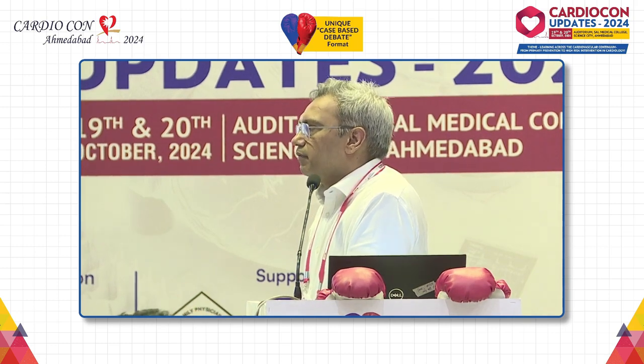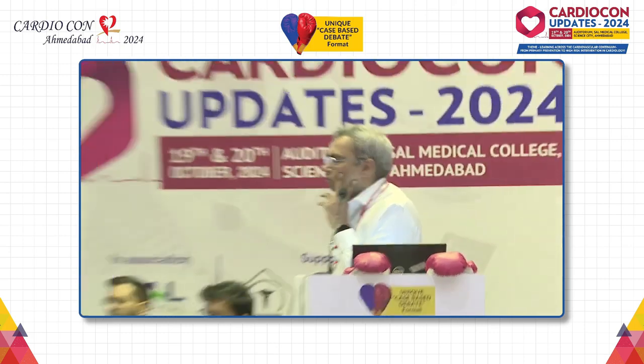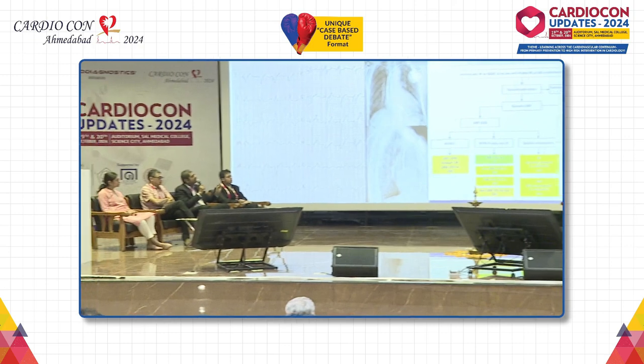So I would only withhold conduction system pacing in those patients where there is septal scarring. That is what we just discussed, that in that case, what Dr. Samir pointed out was the next option: if you are not having left bundle pacing lead parameters on the table, then obviously switching over to CRT is an option.